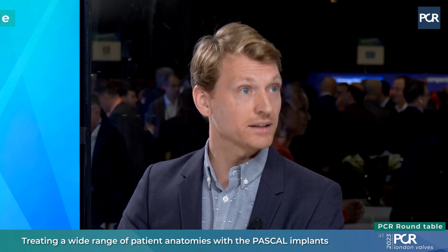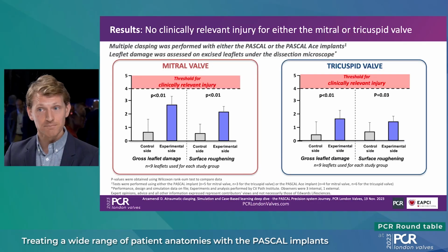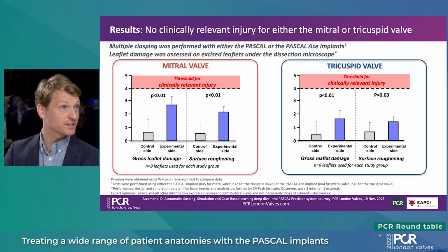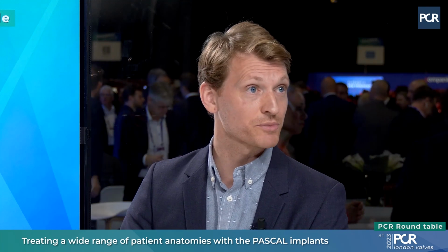So that's my clinical experience. And it's obviously very difficult to prove that clinically. We all have a feeling, but what about bench data? What about lab data? There is actually bench data out there supporting exactly that approach, that multiple leaflet grasping and also multiple closing of the device does not significantly harm the leaflets and does not result in significant clinically relevant leaflet damage. So there is data out there supporting what we do in practice.